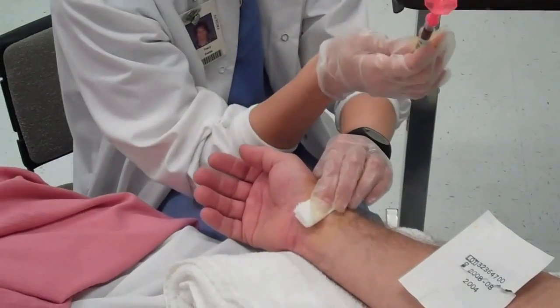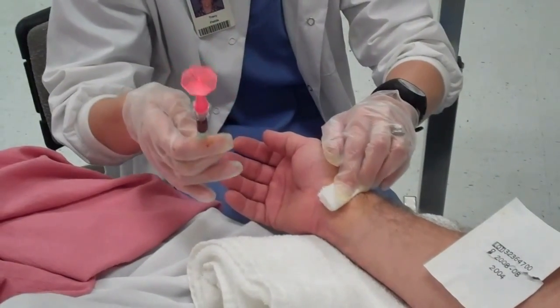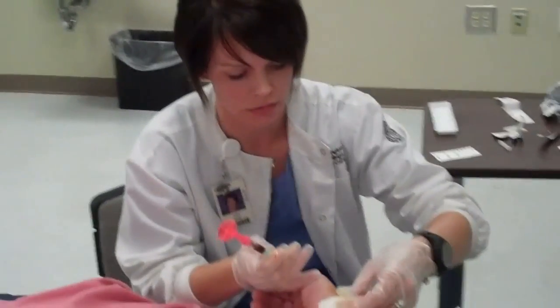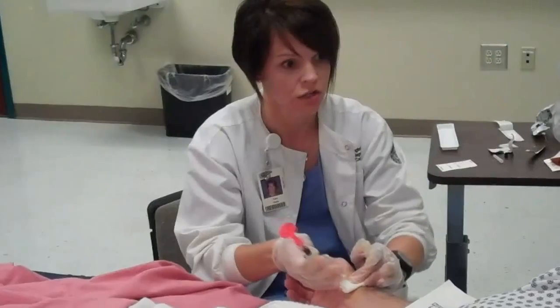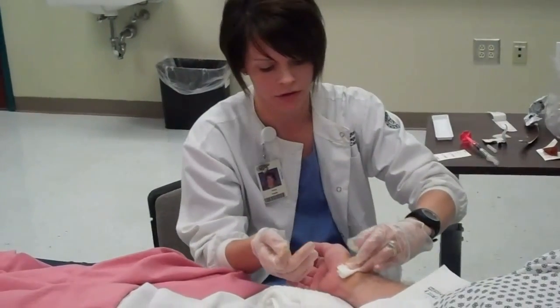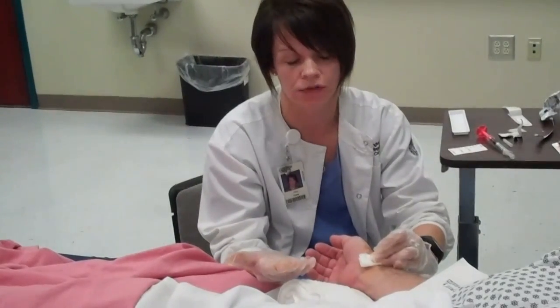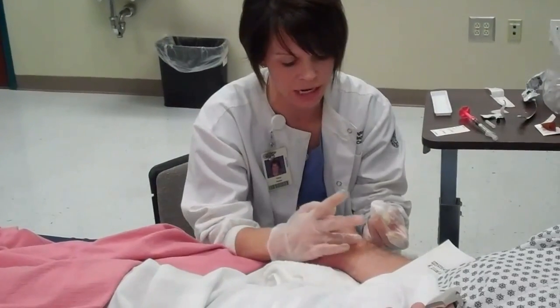So holding pressure. At this point, as a beginner, sometimes you may find it difficult to do multiple things. You need to be very cautious with the needles — we do not want you to end up splashing blood. So I'm holding pressure. The site looks good. It's recommended that you hold for a total of five minutes. So it's been five minutes — I'm re-evaluating my site. Looks good.